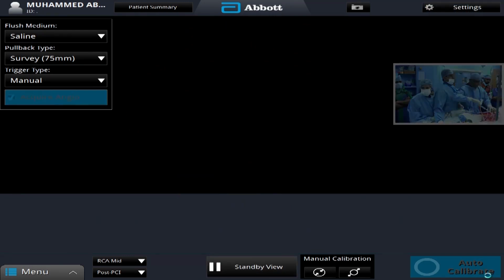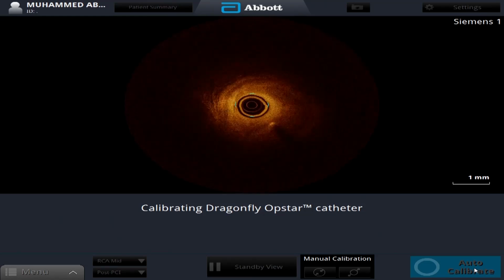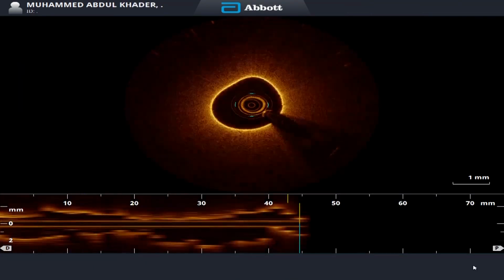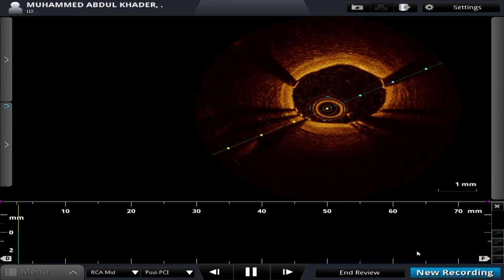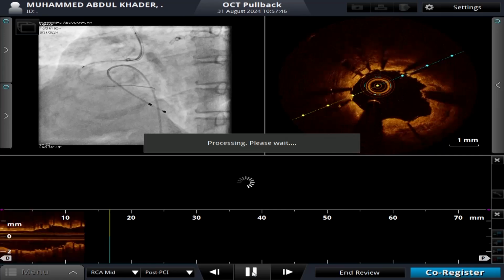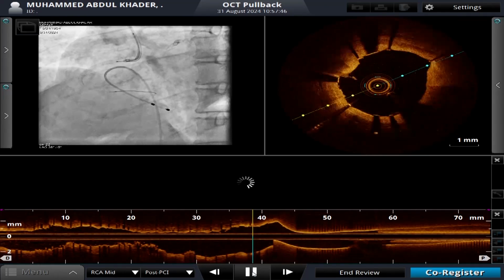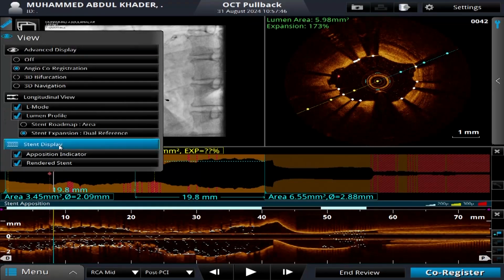Okay, are you ready? Friction will be there. Yes. Okay. Now we'll give some nitro.